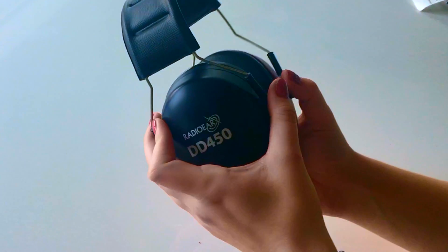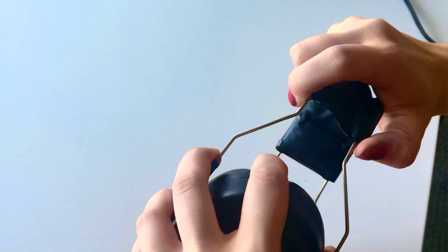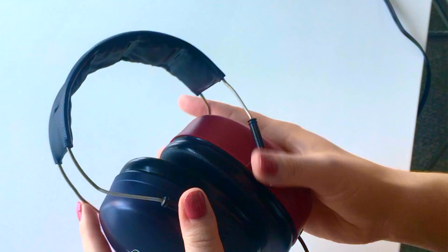Secondly, you'd like to estimate the size of the headphone. This particular model works best with a two-handed adjustment, and therefore you want to get as close to the correct adjustment as possible prior to putting the headset on the patient's head.